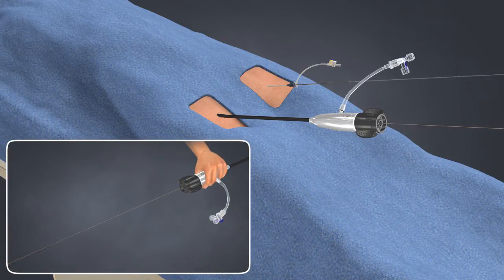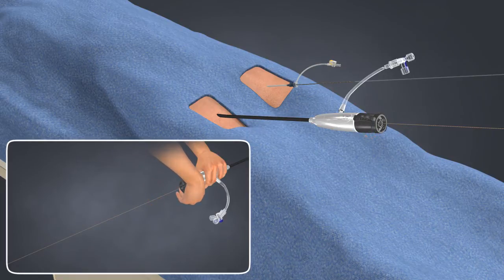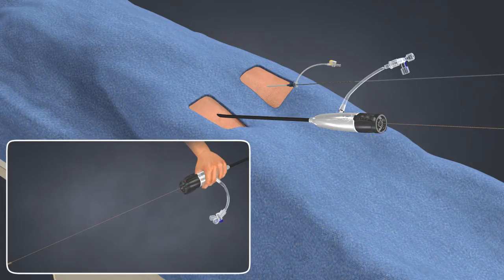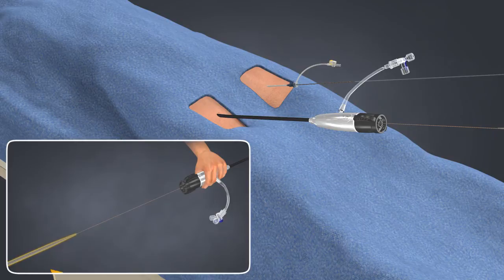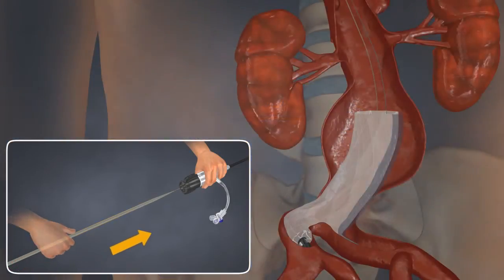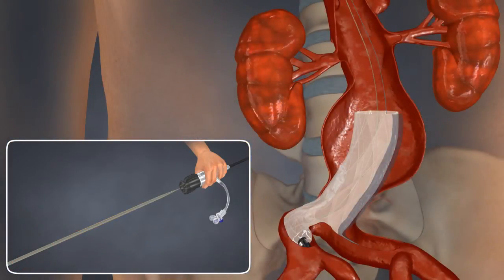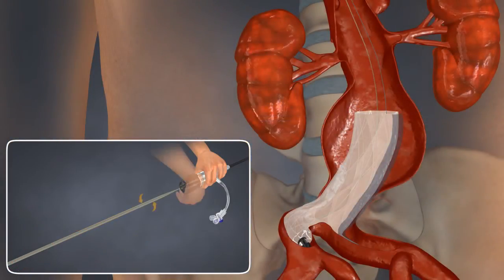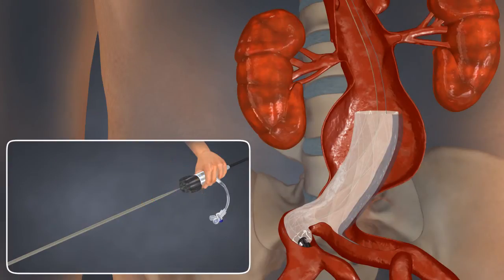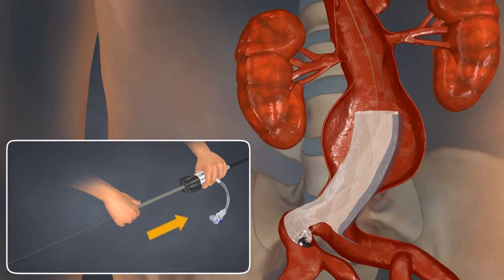Upon removal, tighten the hemostasis valve. Over the 035 guidewire, place the single lumen dilator. Maintaining the position of the introducer sheath, loosen the hemostasis valve and then insert the dilator fully into the introducer sheath.